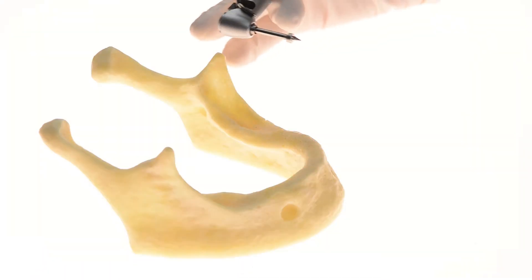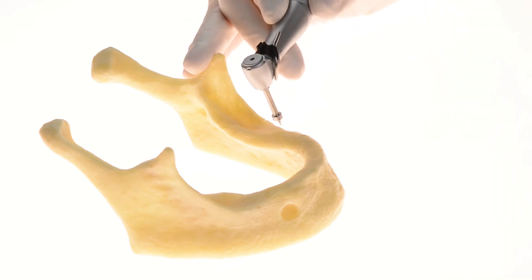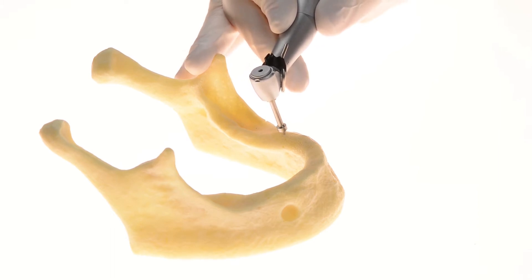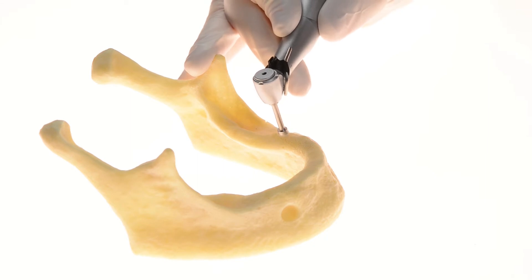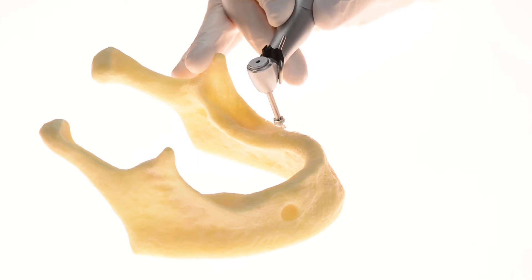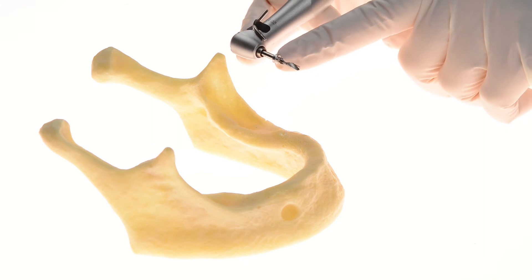The marking drill is used to start off the drilling sequence in an accurate manner. Its ring has a 4mm diameter indicating the final implant position. After marking the correct drilling spot, we continue with the pilot drill.